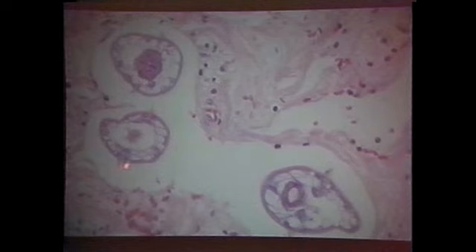Here's your pinworms. Everything has pinworms, people. I mean, it's not only chimps. Cockroaches have 3 or 4 different types, if you would like to study that. But anyway, they have this rhabditoid type of esophagus. This is a glycerin-prepared kind of whole mount, but this you can find in tissue section as well, so use it. The pinworms usually, I say usually, have lateral alae.